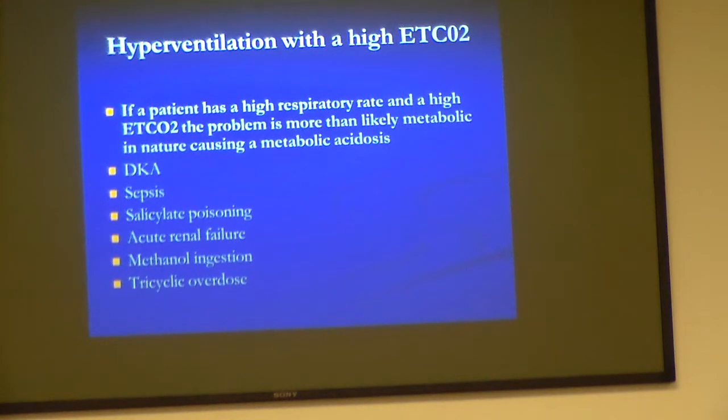And you might have a high end-tidal CO2. This would probably relate more if you had your patient on sidestream. Most likely, you're not going to have a DKA patient intubated in the field unless they have some other issue going on. But these are patients you might have on sidestream. And sidestream, I think, is just kind of interesting to see where they're trending, what's going on with them, if you really feel that you need to monitor their end-tidal CO2. So that's what you will see.